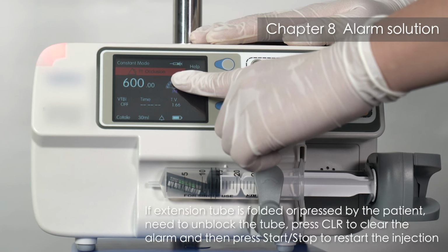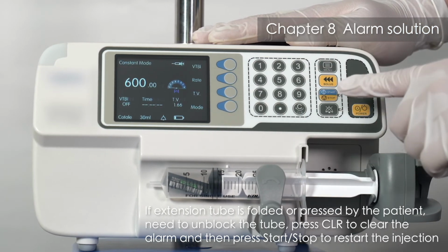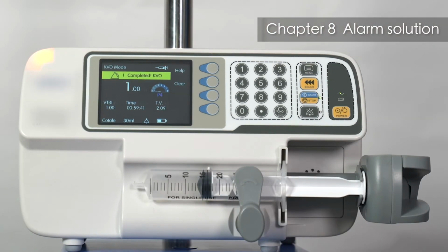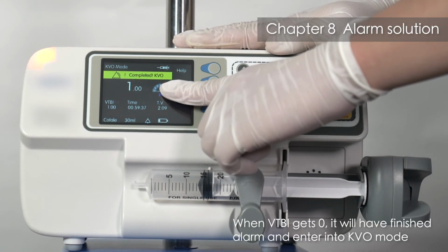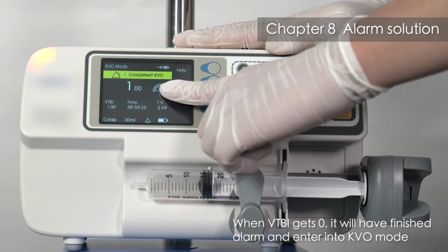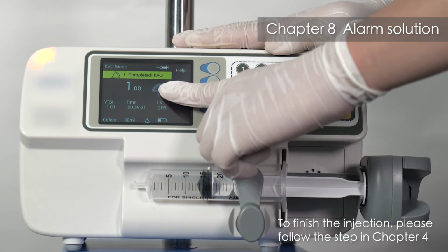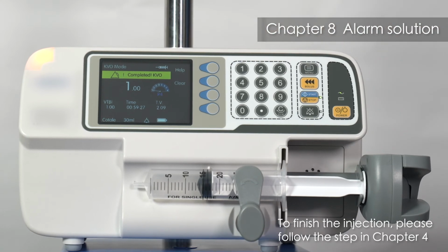If extension tube is folded or pressed by the patient, need to unblock the tube, press CLR to clear the alarm, and then press Start/Stop to restart the injection. Injection finished. KVO. When VTBI gets 0, it will have finished alarm and enter into KVO mode. To finish the injection, please follow the step in Chapter 4.